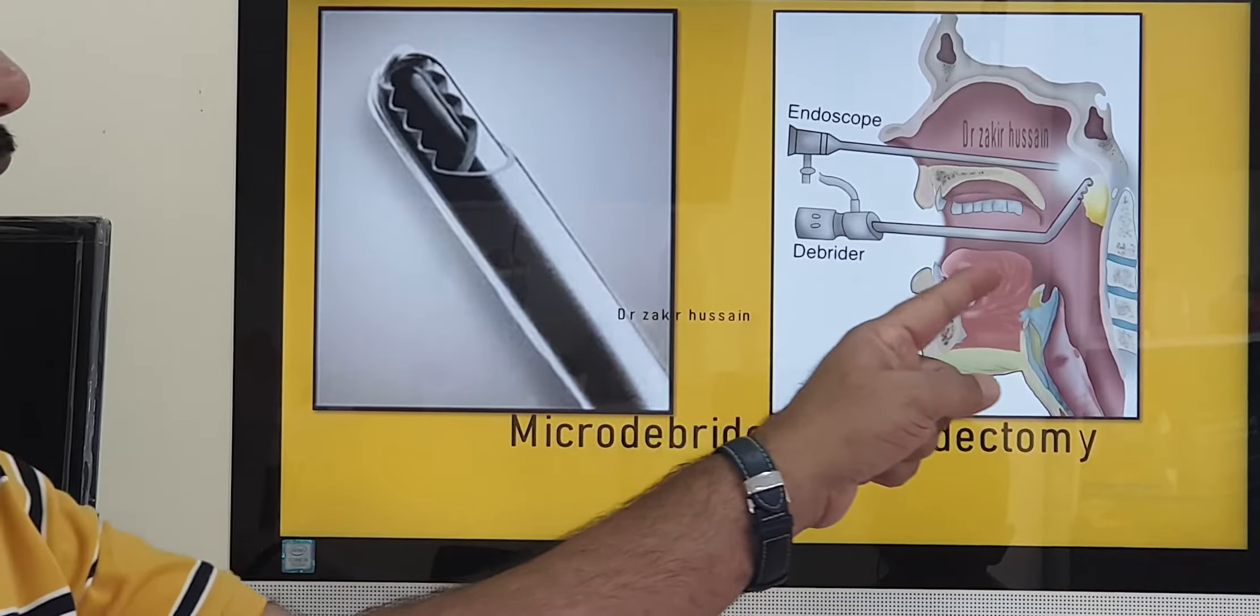Wherever this blade comes in contact, it eats up the tissue. By direct visualization and with the help of the debrider, we can completely remove the adenoids. This technique is called microdebrider adenoidectomy. This is the second technique.